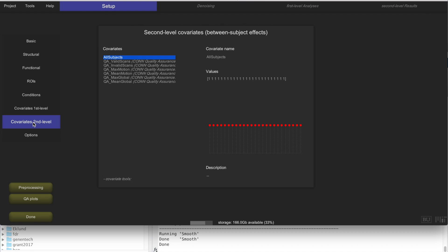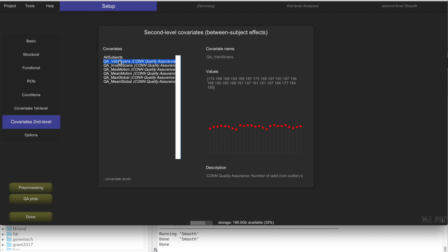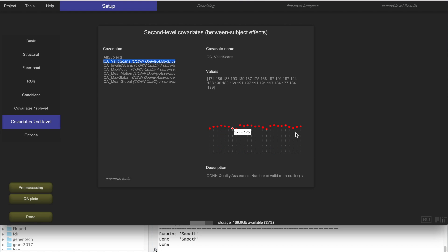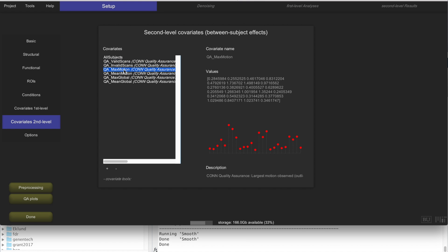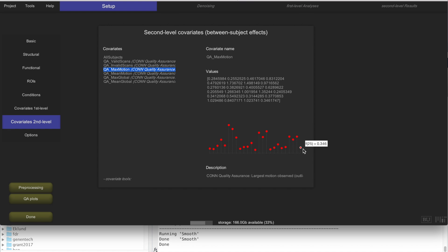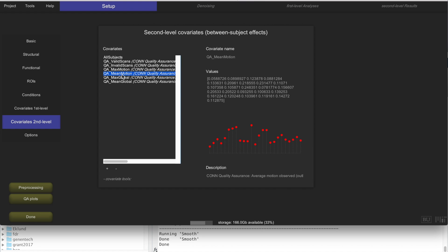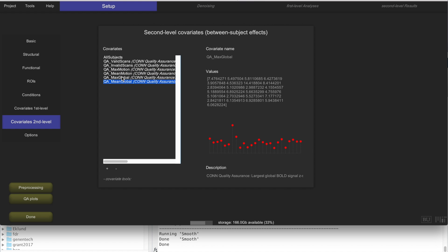The last thing added automatically by preprocessing are quality assurance covariates representing different aspects of data quality for each subject. This includes the number of valid scans remaining after outlier identification, the number of invalid scans — you want these to be relatively similar across subjects. If some subjects have a very low value compared to others, that's potentially problematic. You also have max motion and mean motion, plus two quality assurance measures for maximum and mean global signal change across the scanner.